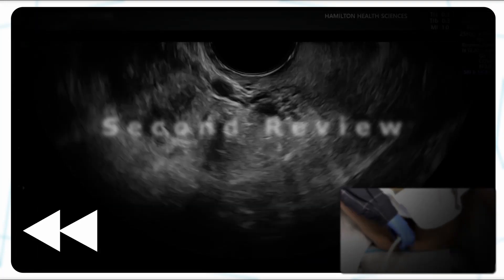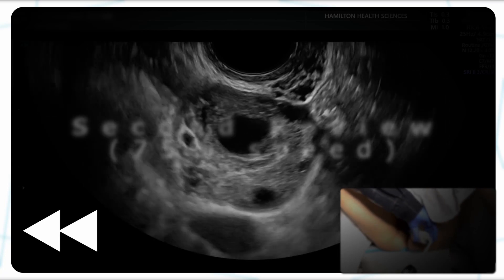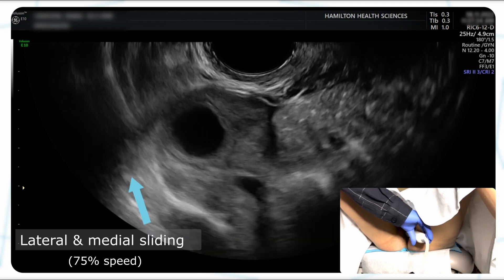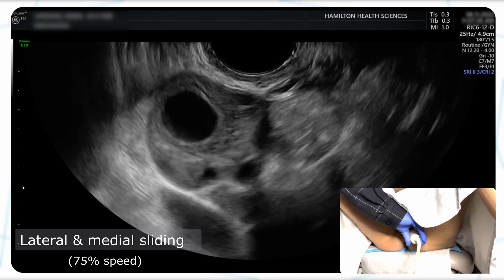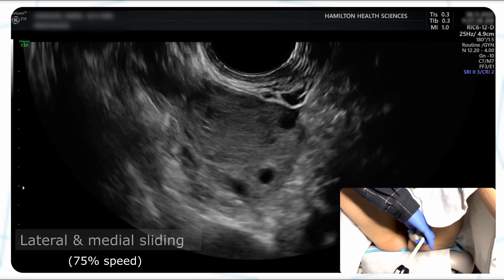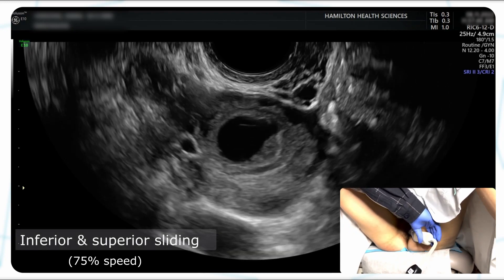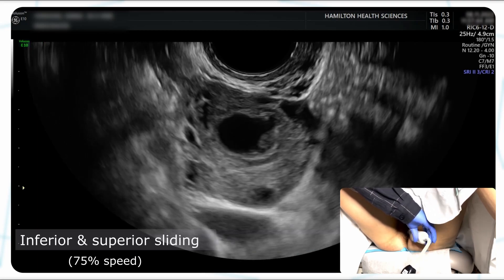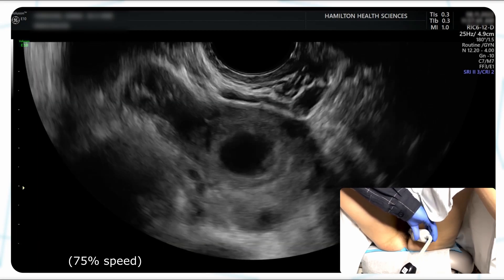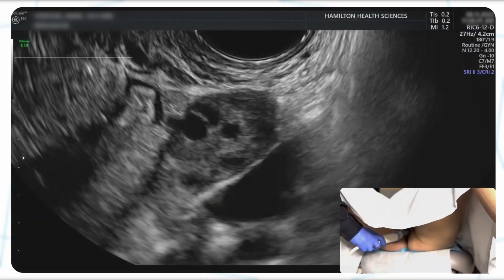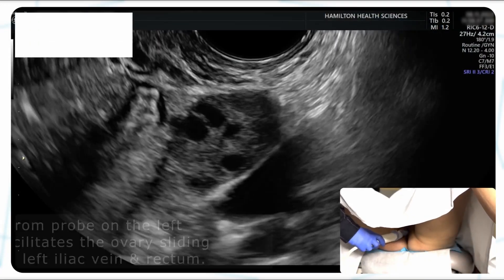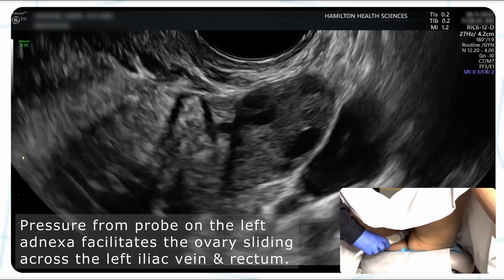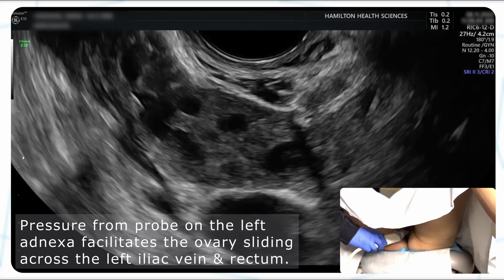Taking a second look at this footage, we'll evaluate all four planes of mobility. As transvaginal pressure is applied to the adnexa while starting in a transverse view, lateral and medial mobility can be assessed as the tissue freely glides past the ovary. Applying pressure again in transverse, we see the ovary slide nicely along the iliac vessel and along the rectum.